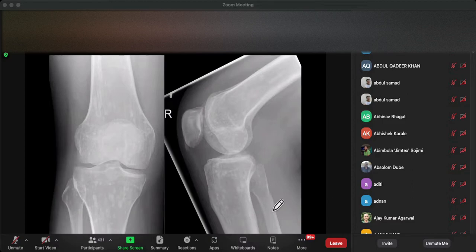What's this condition here? Osteopoikilosis, yeah. And we do nothing about it, okay? Because this is not associated with any pathology. So it's a leave me alone lesion. And they tend to be around the joints, torpedo shaped bone islands, which are orientated along the long axis of the bone.